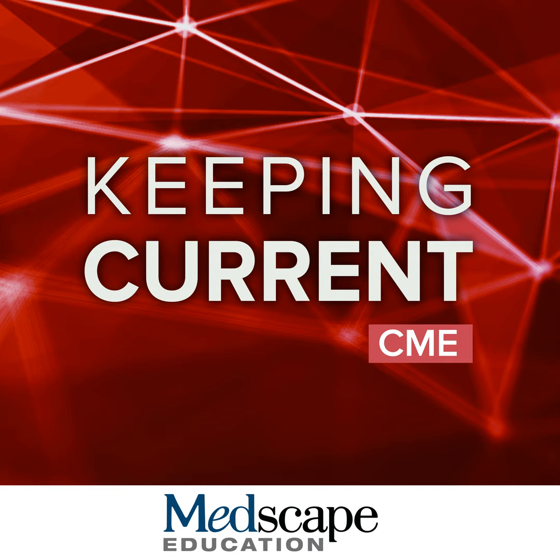Both of these patients had resection. One has HCC, and another one had HCC with microvascular invasion. In 2 years, one patient has no recurrence, and the second person presented with recurrence in the same time frame. So again, perilesional hepatobiliary phase hypoenhancement turns out to be a very strong predictive marker. It is a predictor of MVI.